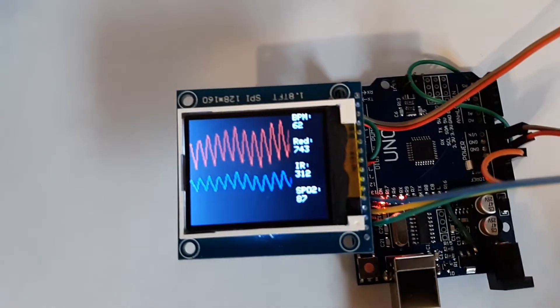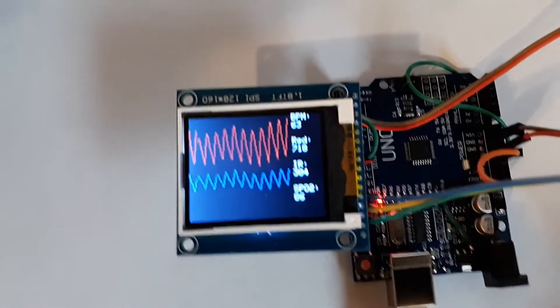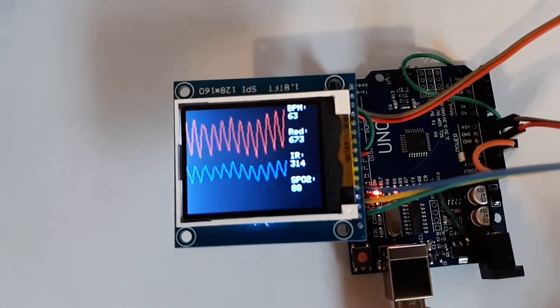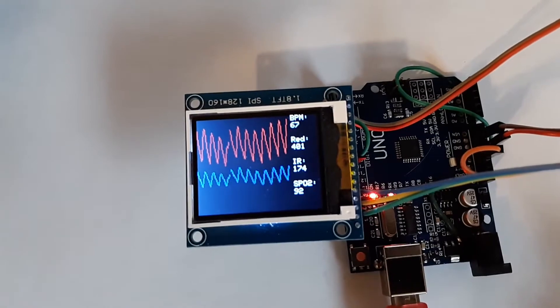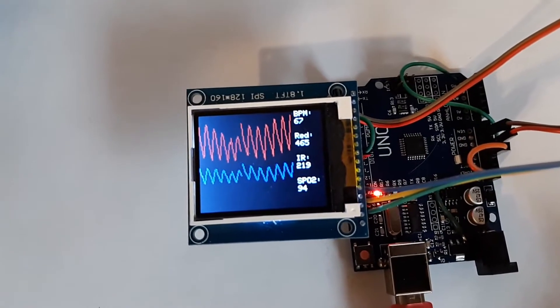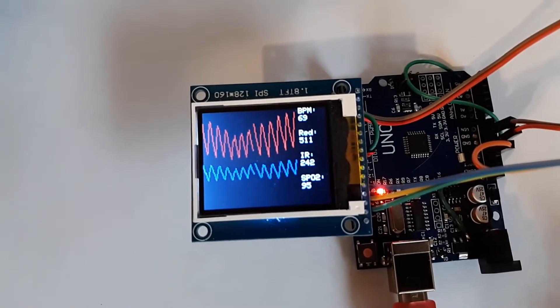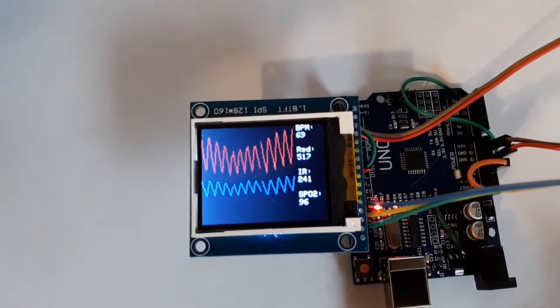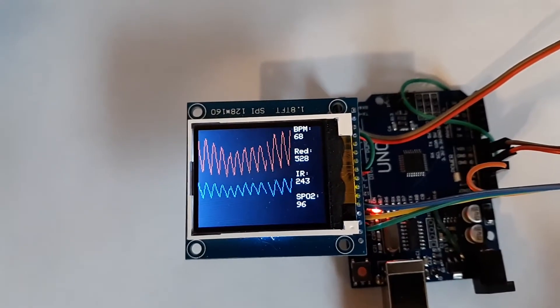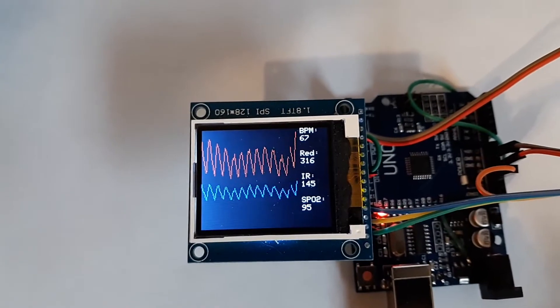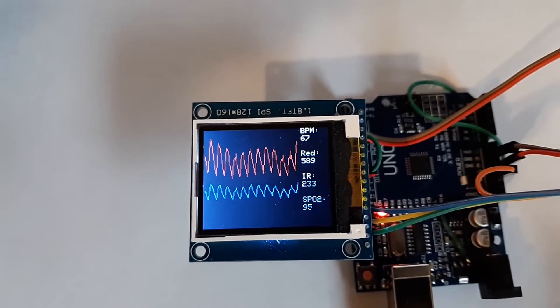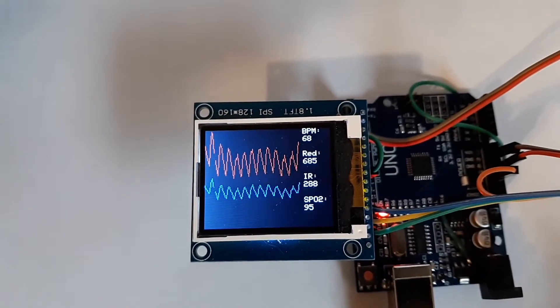This is Bob Davis 321 back with another video. In this case I'm using a Max 30102 to detect heartbeat and oxygen.